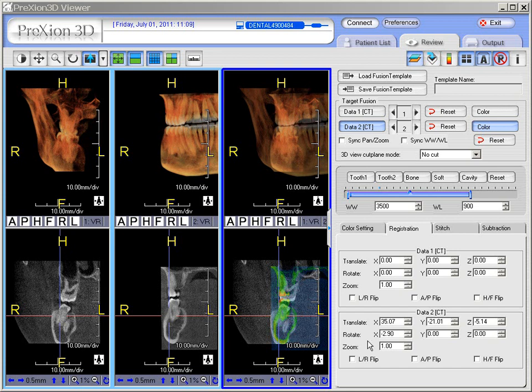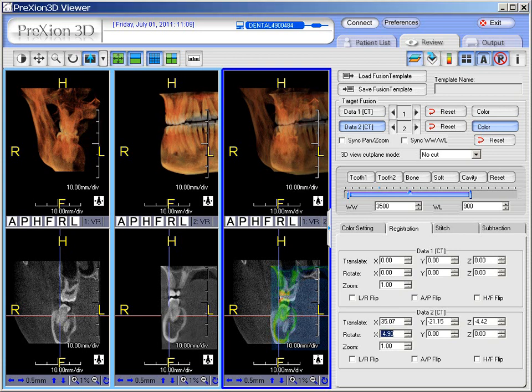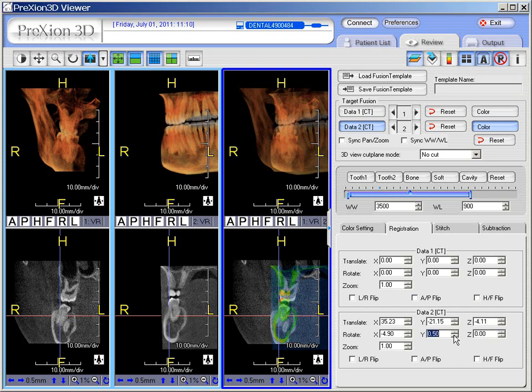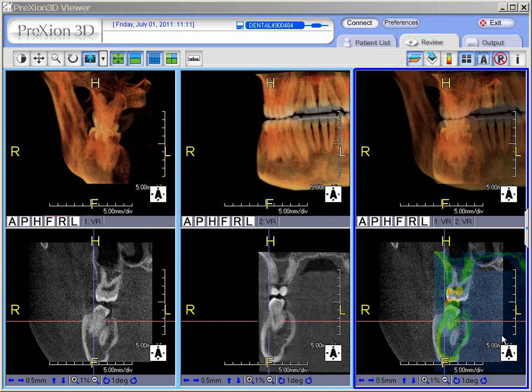Rotate allows us to rotate in the X-plane, Y, or Z-plane. As you can see, we're letting it ride a little bit so you get an understanding of how that is manipulated. Here we are rotating in the Y-plane, and the Z-plane — just to give you an idea of how these items are used and function.